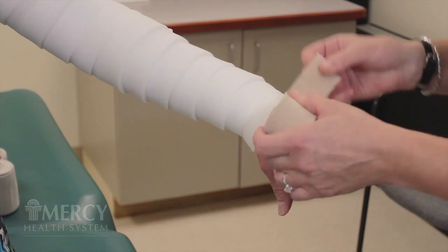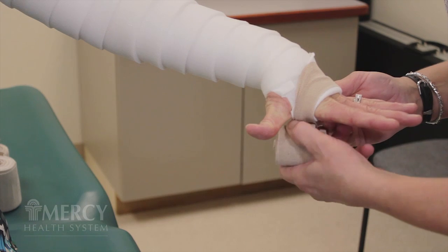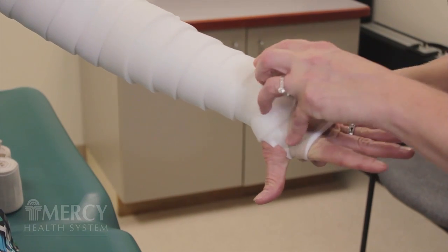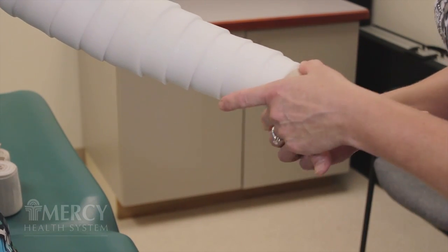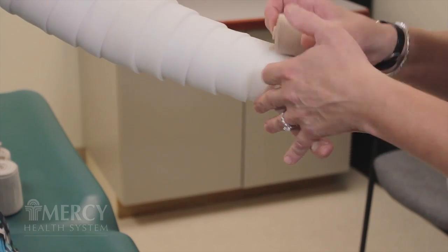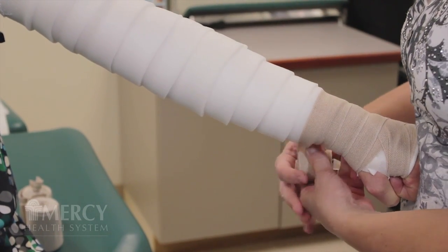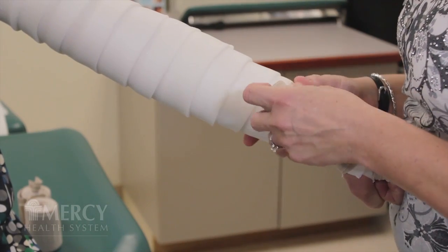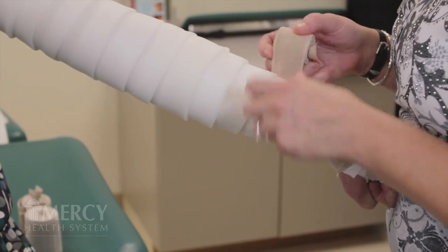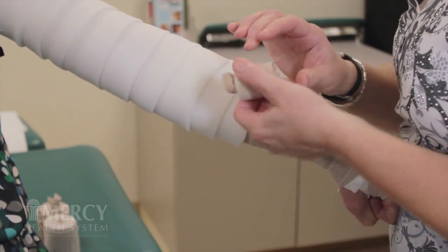We're going to start at the small finger side of the hand. I'm going to take the end and secure it down on Cindy's pinky side. As she spreads her fingers apart, that helps to keep some of the pressure from getting too tight around the knuckles. I'm going to overlap it a little bit there so it doesn't get too tight on the thumb. Once I get that end secured, I'm going to come down to the base of her thumb and then back around. I'm going to bunch it up just a little bit in there so it doesn't bother her thumb, then continue up the length of Cindy's arm, overlapping halfway over the previous layer. I'm keeping my roll nice and close to the foam because if I get too far out, I'll provide uneven compression.